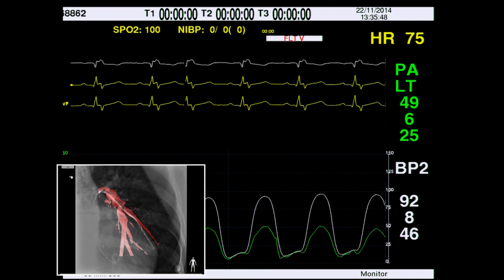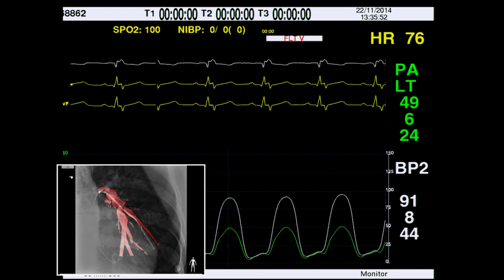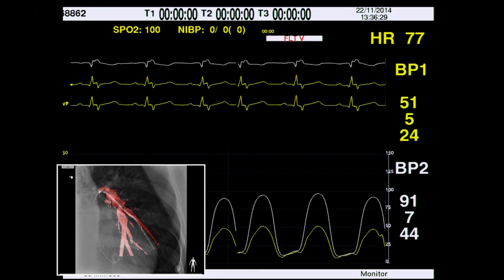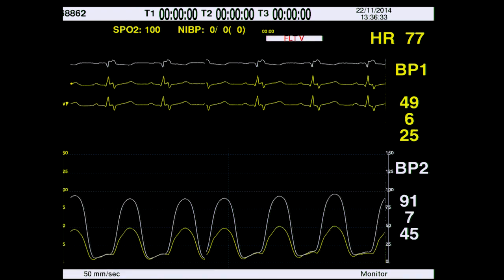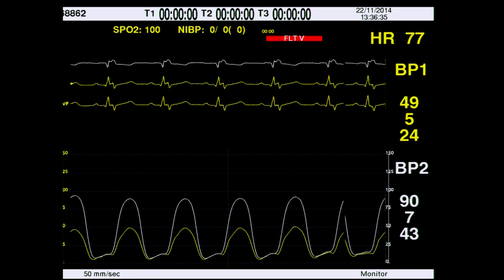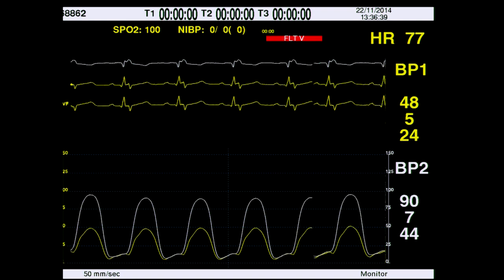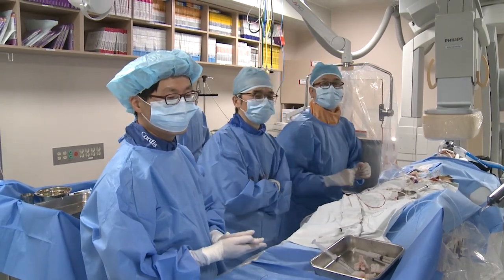It's almost half of the systemic pressure, so that's acceptable. This was a great example of angioplasty on a very complex lesion, and I'm impressed with the changes in RV pressure. You did this all within an hour — congratulations, Sangho. Thank you.